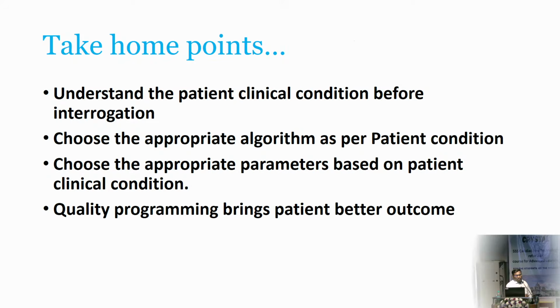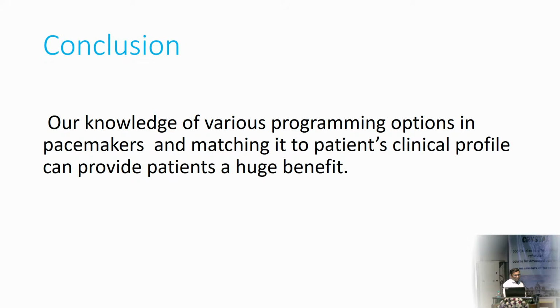So just take-home points. Understand the patient's clinical condition before interrogation. Choose the appropriate algorithm as per the patient condition. Choose the appropriate parameters based on the patient's clinical condition. Quality programming brings better outcome. So, conclusion: our knowledge of various programming options in pacemakers and matching it to the patient's clinical profile can provide the patient a huge benefit. Thank you.